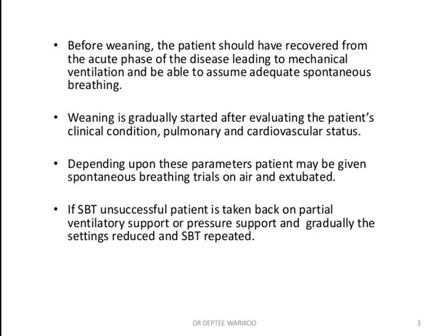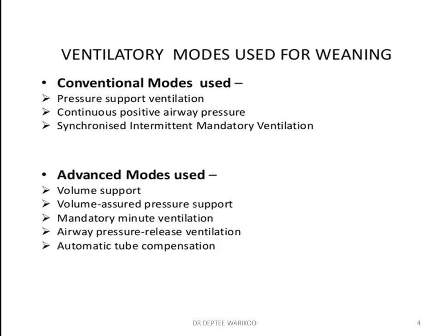If spontaneous breathing trials are unsuccessful, the patient is taken back on partial ventilator support or pressure support, and gradually the setting is reduced and the SBT is again repeated. SBT is spontaneous breathing trials. There are various difficulties while we perform weaning on the patients.